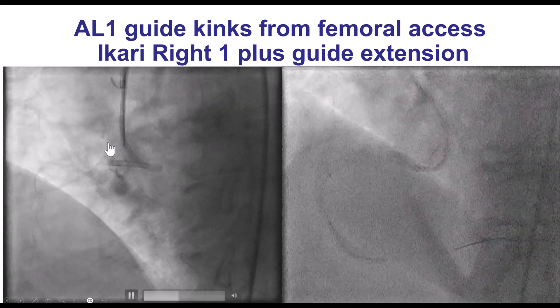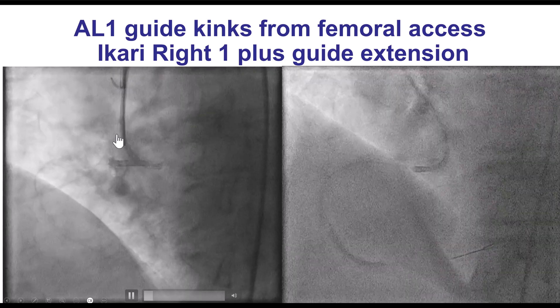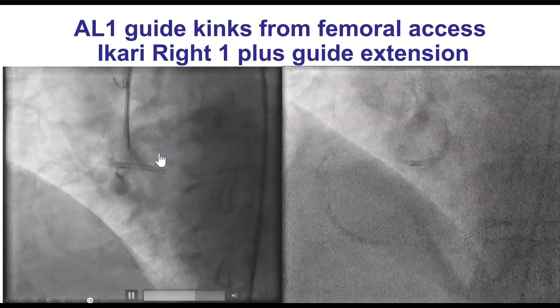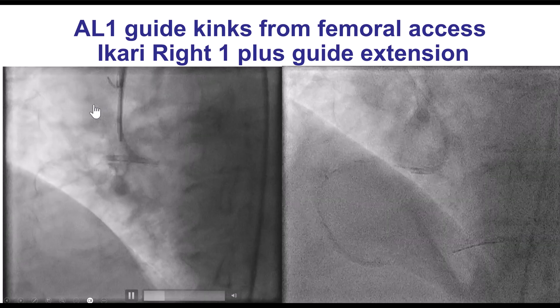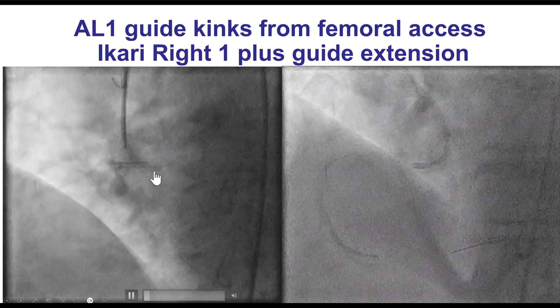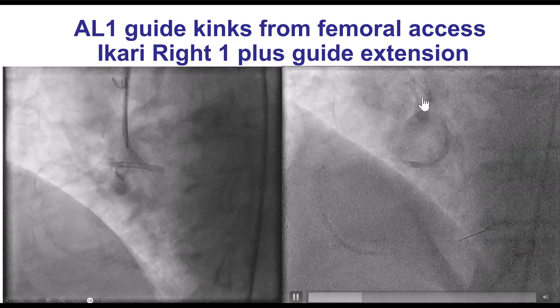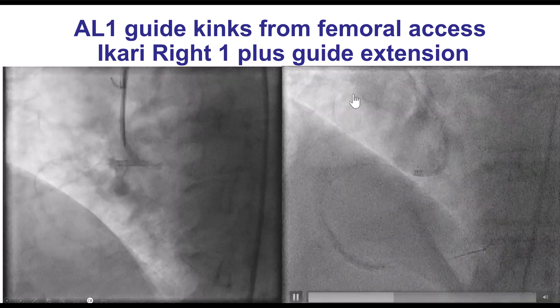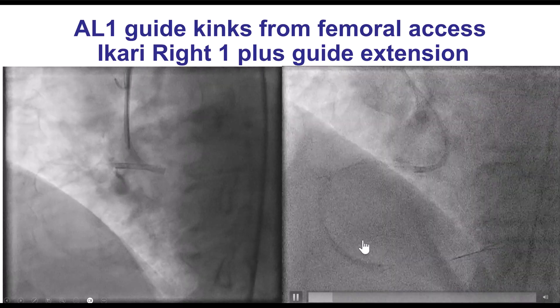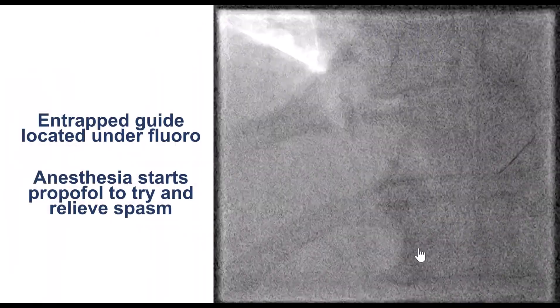We decided to proceed with PCI of the right coronary artery through the femoral axis while performing all these maneuvers for the radial. We tried an AL-1, but the guide catheter kinked. We eventually had to use an Ikari Right-1, which is a radial guide used through the femoral, to be able to engage the right coronary artery and predilate.